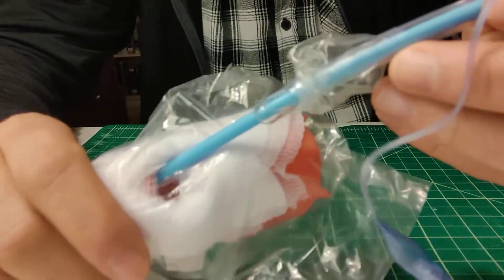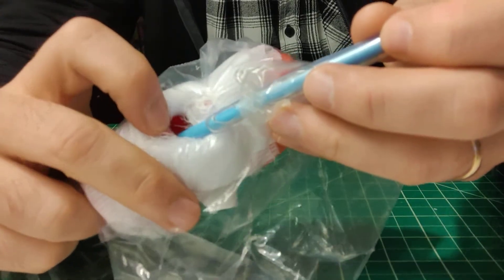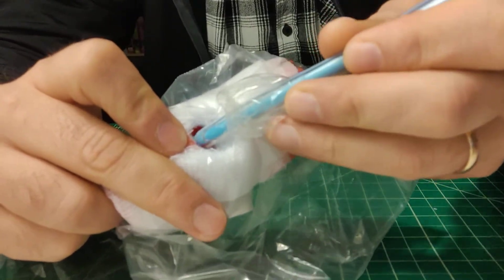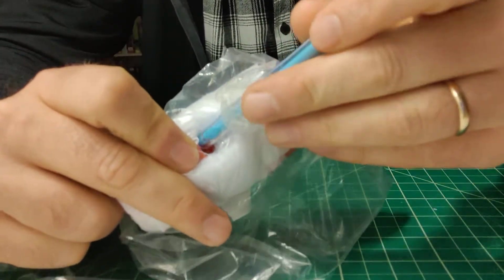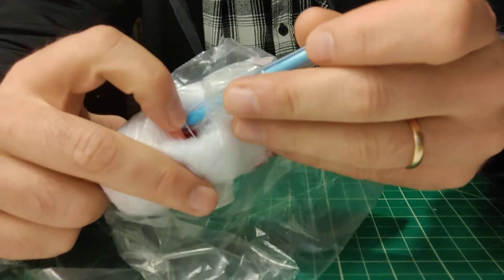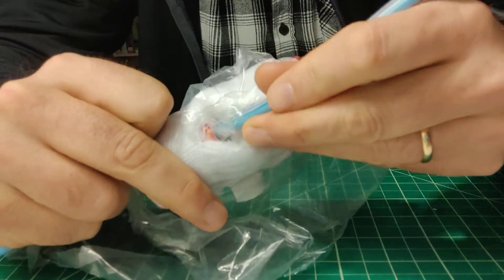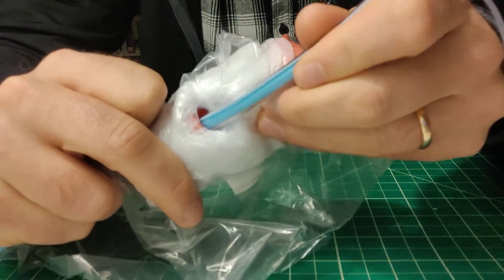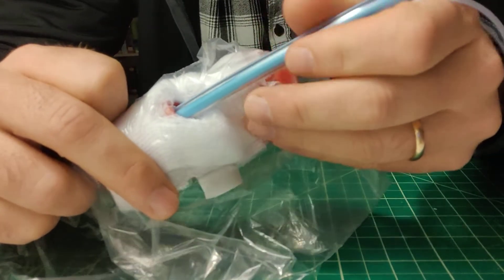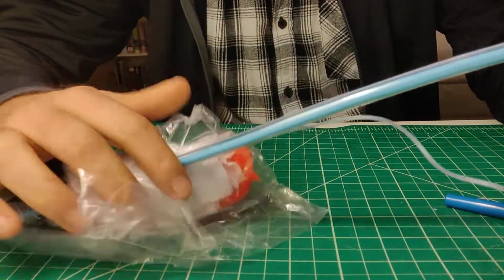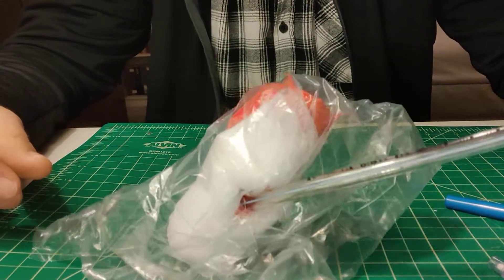Now, one thing I'll tell you when you're advancing your tube, and let me see if I can get up close to this. When you're advancing your tube, sometimes the tip of the tube will get caught on the cartilage right there. So as you're going in, if it gets caught, like it's getting caught right now, just push it in a little bit as you're going in. A lot of times people just will be so amped up and they'll be trying to shove this thing in and won't go in. It's just because it keeps getting caught on the lip there. So just give it a little bump. It'll slide in there. And then what you want to do is just slide that tube in just until the balloon disappears. You don't want to advance it any further than that, or you'll right main it or something. Okay. You take your bougie out, inflate your tube and start ventilating. Super easy. That's it.